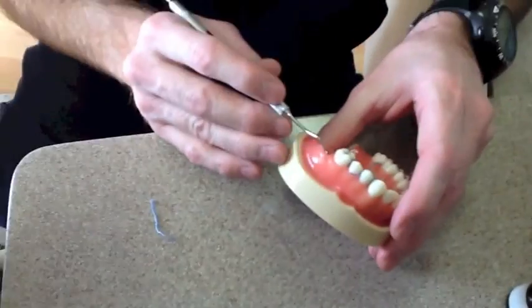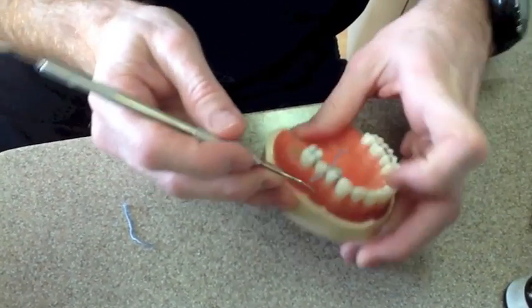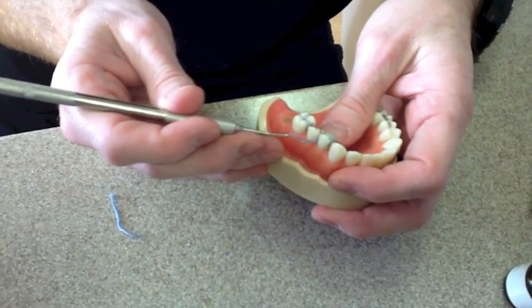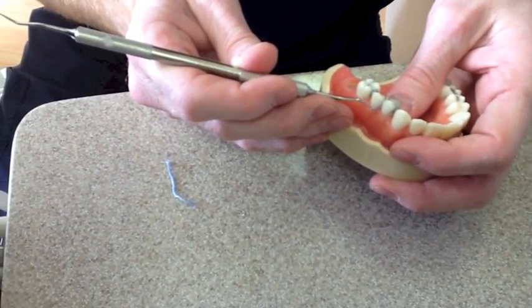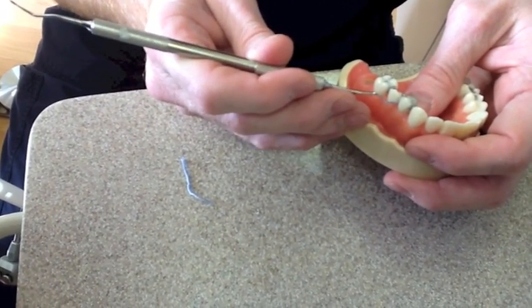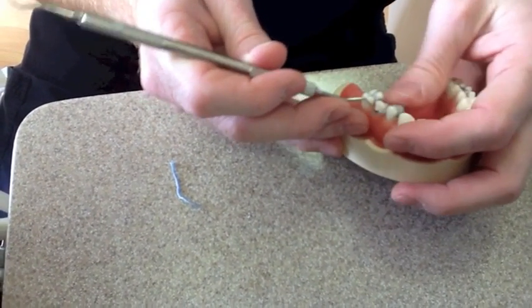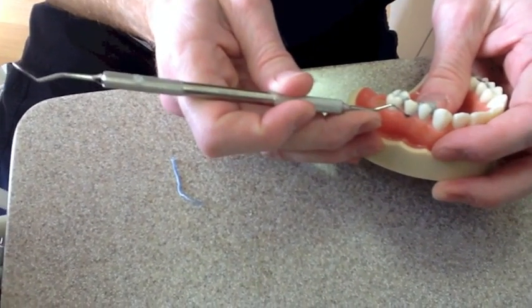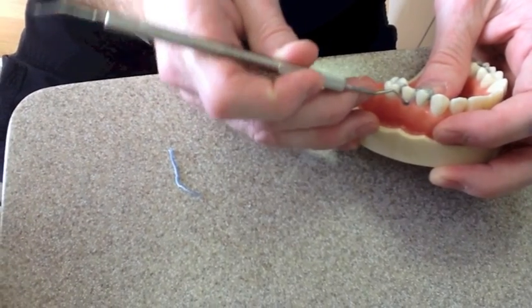So here's this tooth that's kind of been trimmed for a crown. We're going to start by, let's see, I'm going to get it to where you guys can see it. I'm going to get the edge of it. It's harder when it's not wet. I'm going to pull it tighter, because when it's wet you can wrap it. Okay, you can take the edge of it and I'm going to push it down in there. Okay, I'm going to push it right in there.